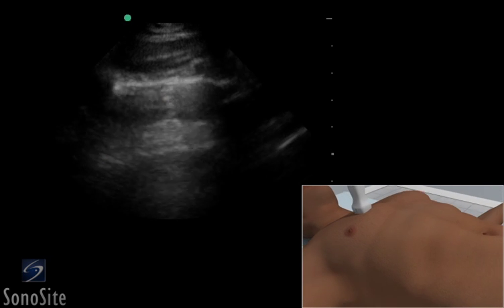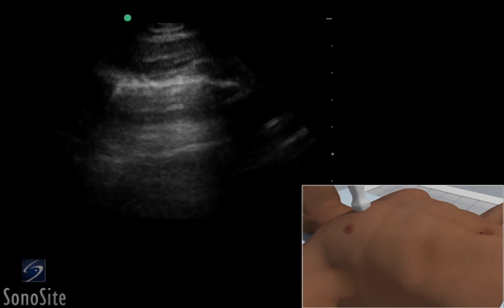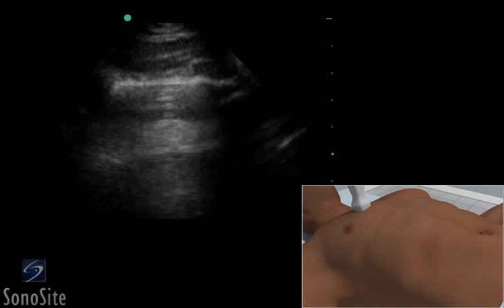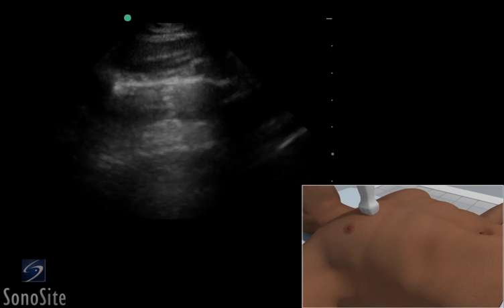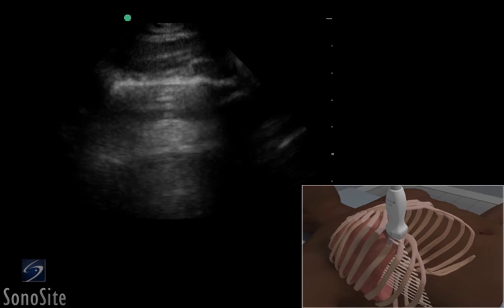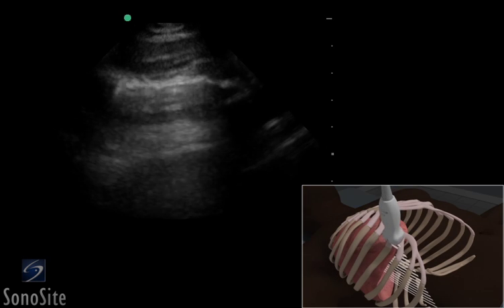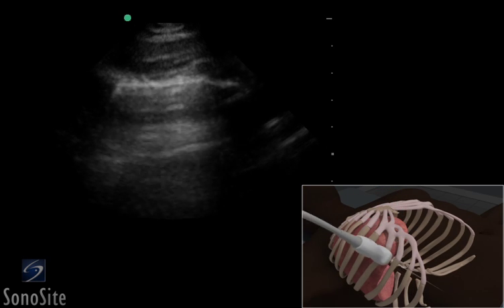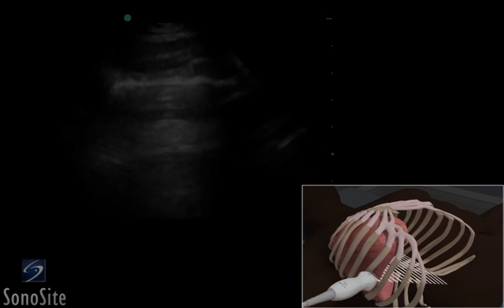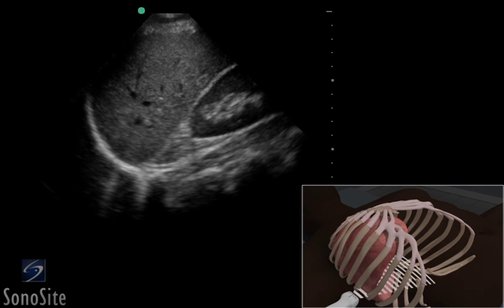To evaluate the posterior pleural space, move the transducer distally to the level of the seventh intercostal space. Slide the transducer posteriorly to the midaxillary line, and increase the scanning depth to view the interface between the pleural space and diaphragm.